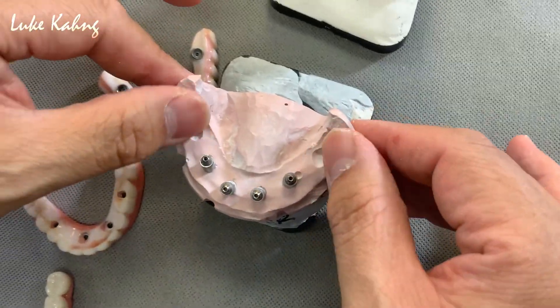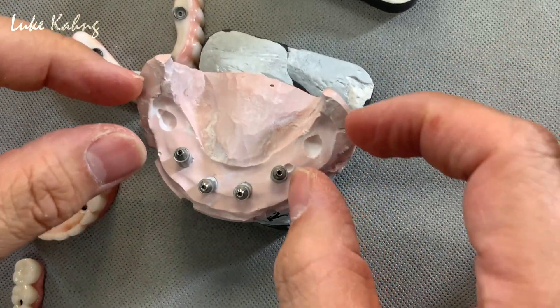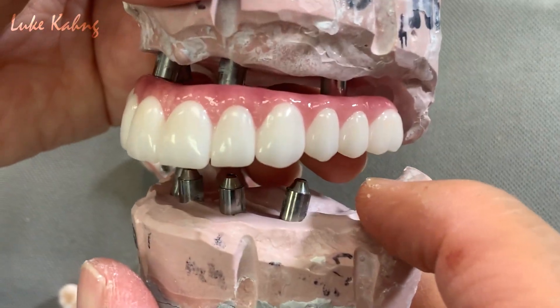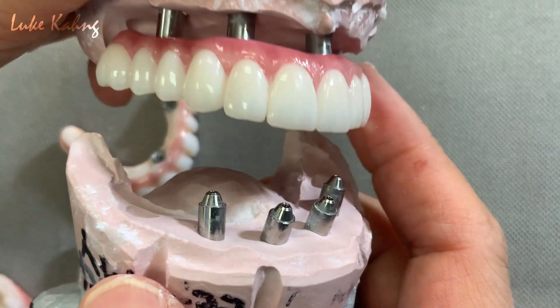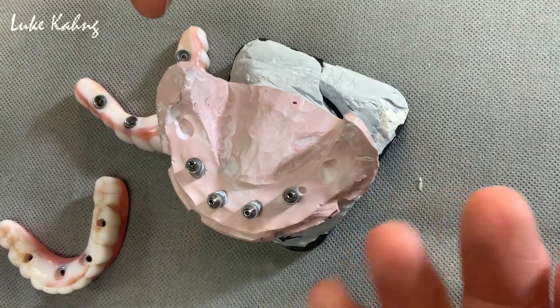Whenever they place an implant and this is too long, they will worry about the occlusion — they will be biting that area, which is very critical. It might not crack, but who knows, sometimes it cracks.